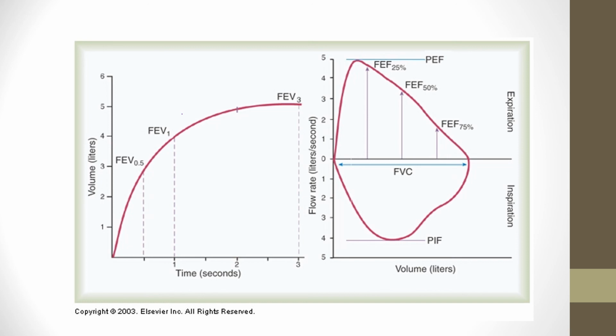All right, so as the patient exhales, that's what you're seeing here with the graph, right? They're exhaling, it's moving up in volume until they reach as much volume as they can out. Over here on the right, you're going to see this flow volume loop, right? Be very familiar with this. Even mechanical ventilators have flow volume loops on them, so you might have to look at them on those.